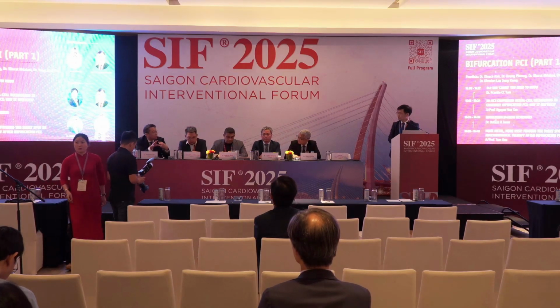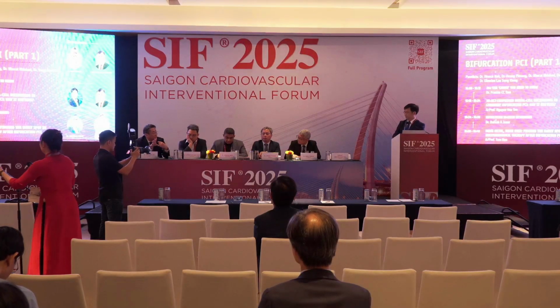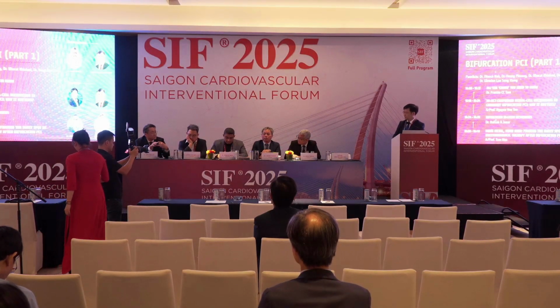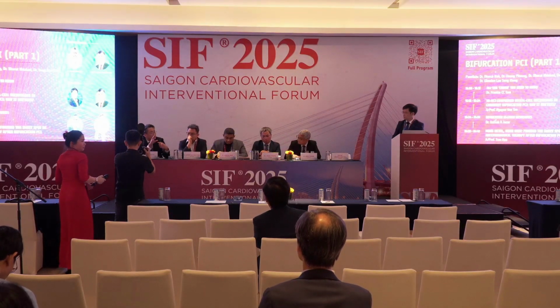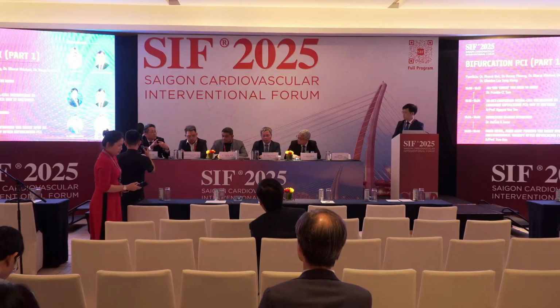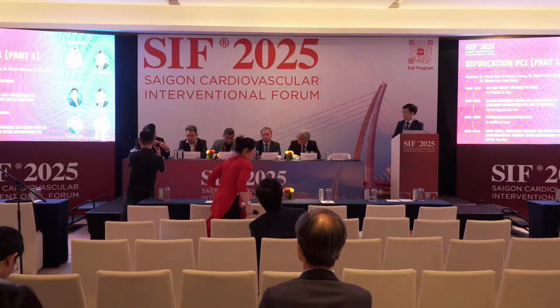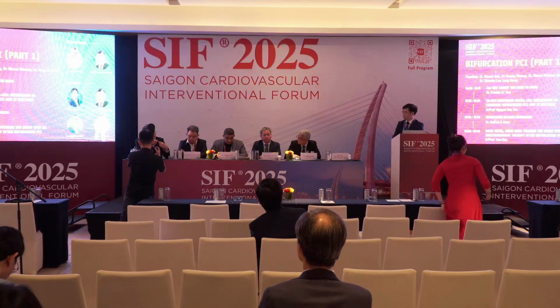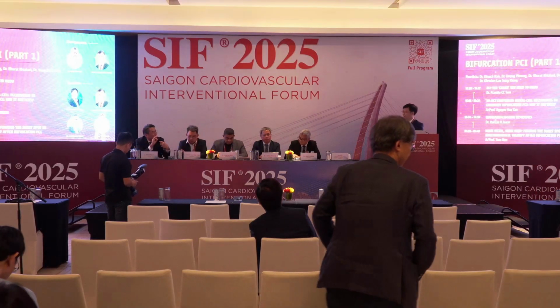Nowadays we almost always use imaging guided PCI for the left main two-stenting technique, in Vietnam and Korea as well. So I think whether it is distal wiring or mid wiring, proximal rewiring, is an important thing. More important is that we have to do image guided PCI with two stenting well. Just my comment.